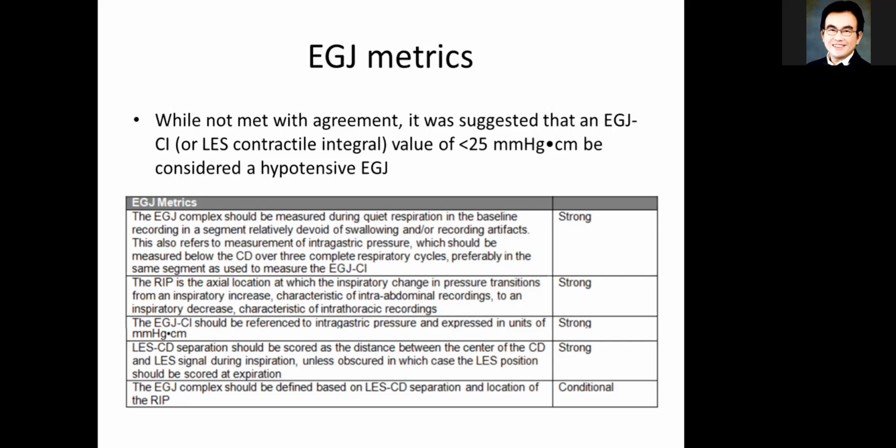And I'm also surprised that they did not include the MMS metric for the IRP. I think it's very important to bear in mind that IRP can really be different between probes, right? So you need to know what the acceptable upper limit of the IRP is for your probe.